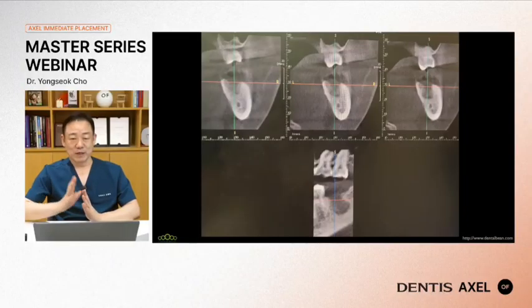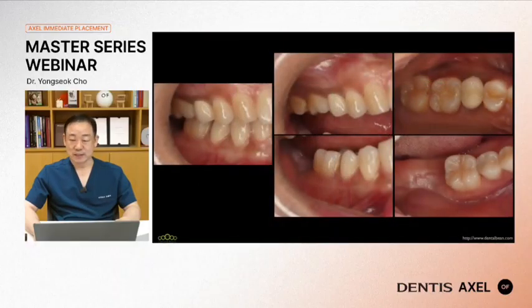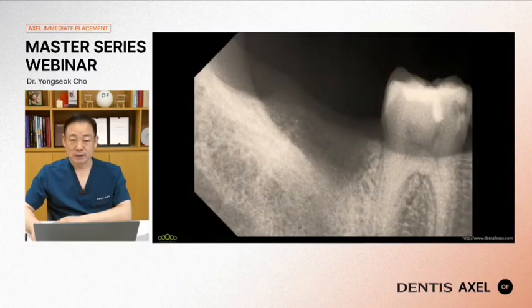Look at the very low bone density, and maybe it was a type 2B extraction socket previously. Now it is healed like this. The buccal bone lost some amount, and the vertical height is slightly reduced. The periapical view is here. Okay, the coronal bone density looks not so dense yet.